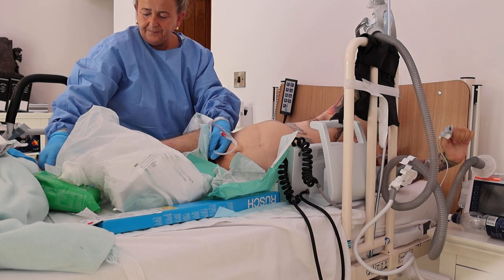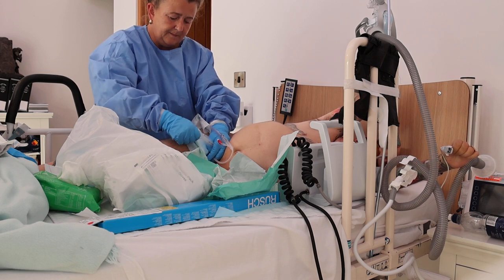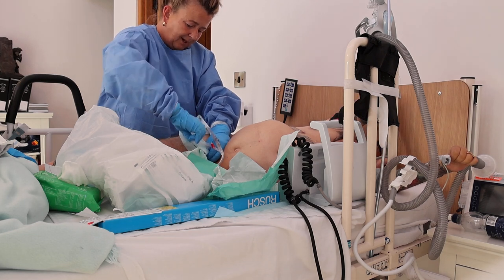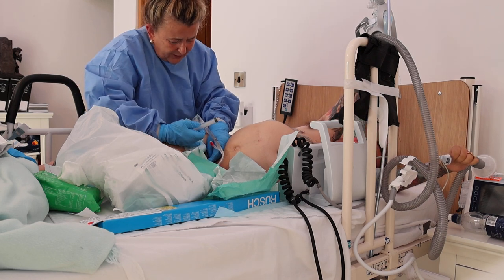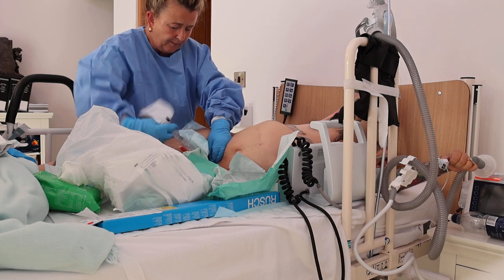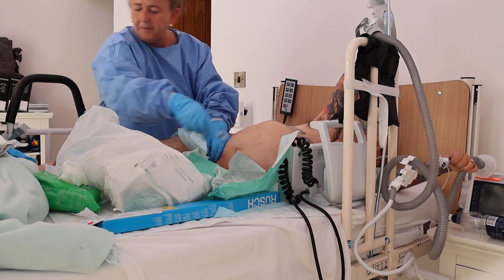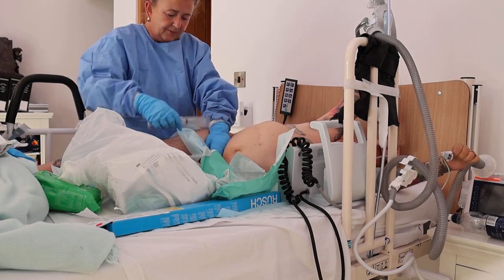How you feeling, Ben? All right. Bit of an ache, but not much. Well, you're going to get a bit of an ache on that one. The one thing I didn't get ready was my syringe here. Got it. I've got so many gloves on. I'm holding the catheter in place with my one hand. So, here we go. Ooh, I've already got a load of sediments on the way through. Hang on. Let me just get these sediments out first. Just making sure, then I'm just going to put some new saline in that. I don't need to. That's fine. How are you feeling? Alright. Sure? Yeah.